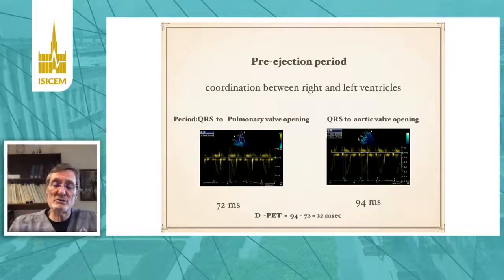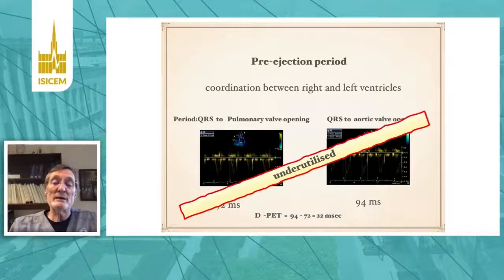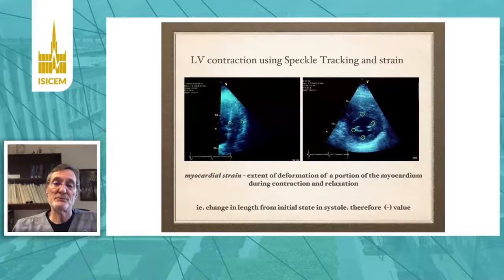And you can measure to see whether this is useful in those patients who are critically ill, who have a low cardiac output. Is the answer not giving inotropes, but in fact adjusting their pacing parameters in their pacemaker? This is probably really quite underutilized because people don't really know that much about it, but it can be very useful in those subsets of patients.